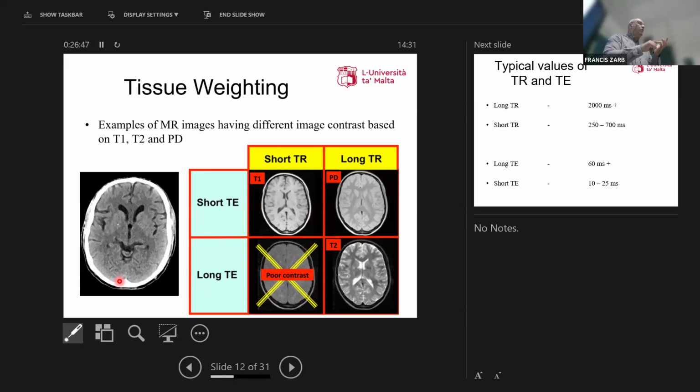But in MRI, we have contrast based on the variation in T1 of the tissues, contrast based on the variation in T2 of the tissues, and the number of protons within the tissue. So we already have three different types of contrast. So we can identify certain tissues much better in MRI than we can appreciate in CT. Because in CT, you have one contrast delineator and that's it. So that is why we need more than one sequence in MRI to get a complete picture of what is happening to the tissues, because definitely we need T1 and T2.